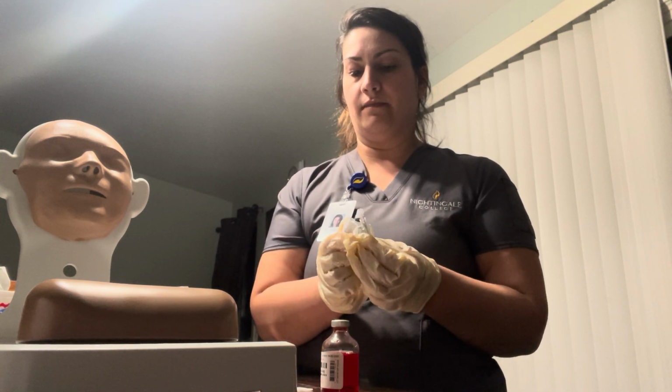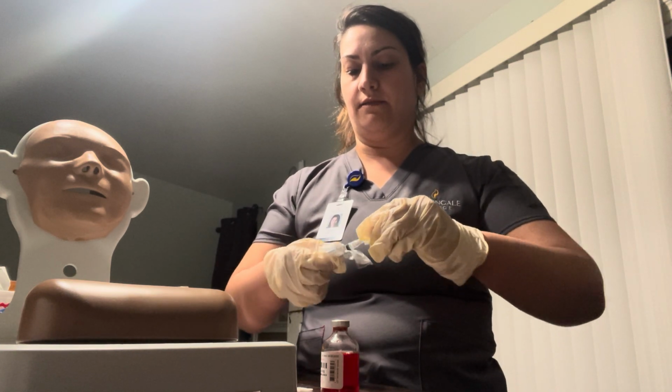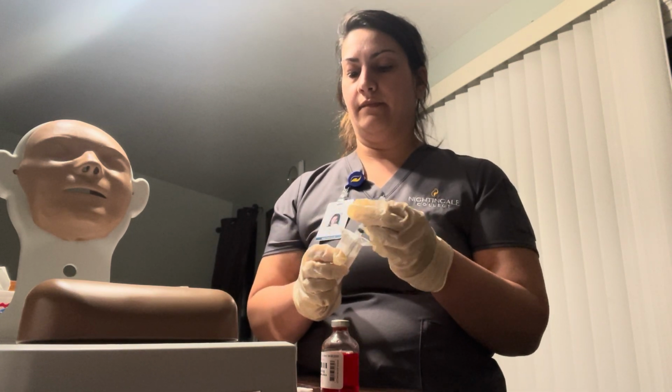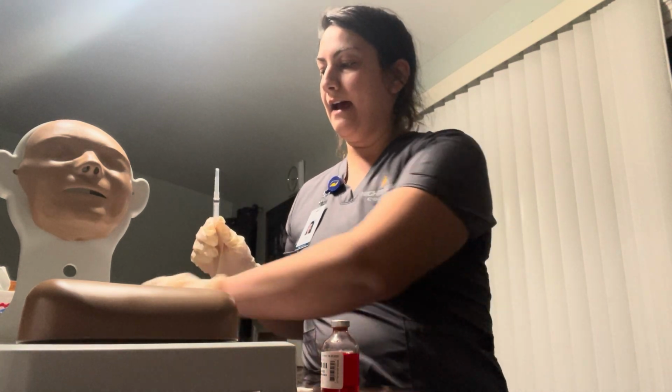Perfect. I'm just going to put it on. All right, next, I'm going to toss that.